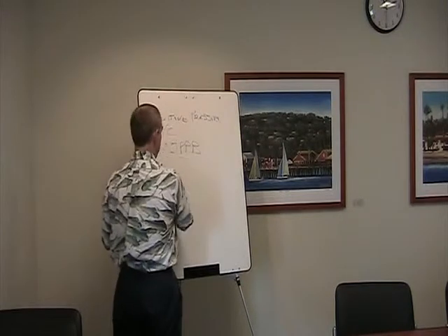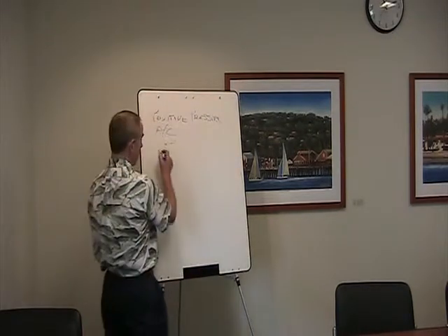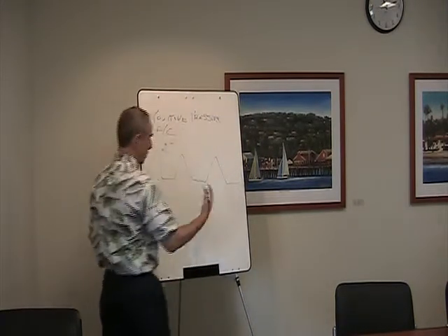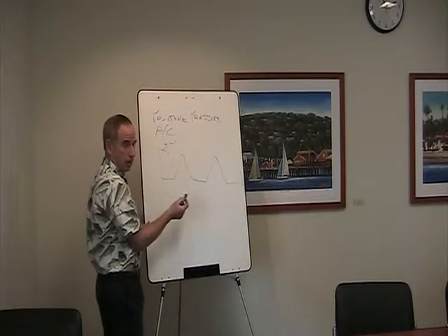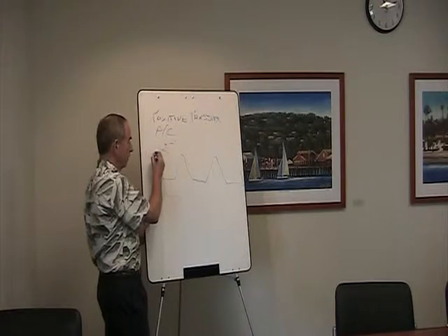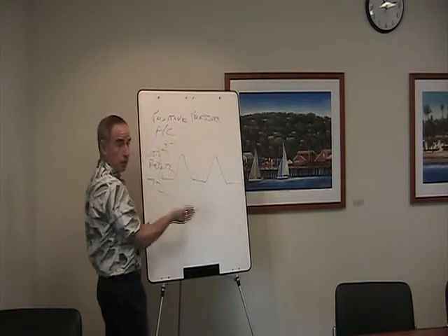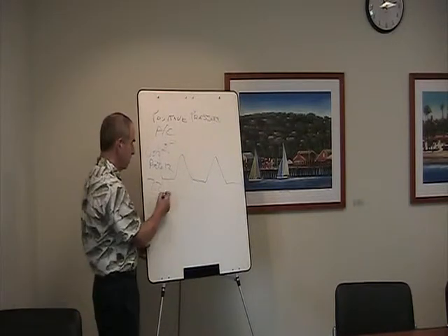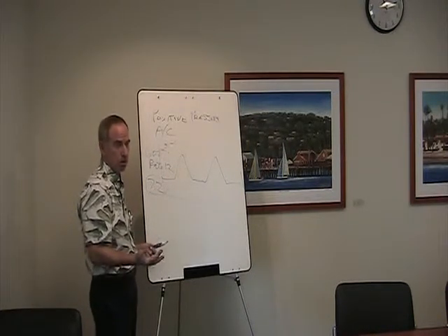All right, so the next type of ventilation that came about was assist control using volume cycle ventilation, okay? And so this was considered a big advance because now not only could the patient regulate their own minute ventilation by taking breaths, but now you could guarantee a minute ventilation with your mandatory breaths, right? The rate is controlled. Now you're setting a volume, and you're setting, say, a rate of 12. So now my minute ventilation is going to be 7.2 liters, guaranteed. And if the patient breathes above that, they'll get more than that. But at least I'm guaranteeing a minimum ventilation for that patient, which we couldn't do with the pressure mode initially.